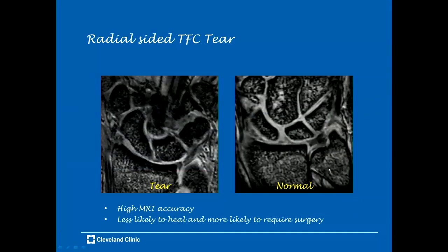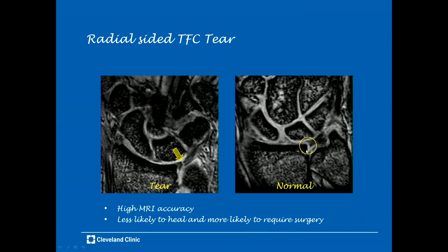Here's a case of a radial-sided tear of the triangular fibrocartilage, where high signal separates the normal low-signal fibers of the TFC. This should be distinguished from the normal high signal at the radial attachment, which is not a tear. Pay attention to the location when calling a radial-sided TFC tear to avoid overcalling the normal attachment. MRI has shown high accuracy for detecting TFC tears, and radial-sided tears are less likely to heal and more likely to require surgery.